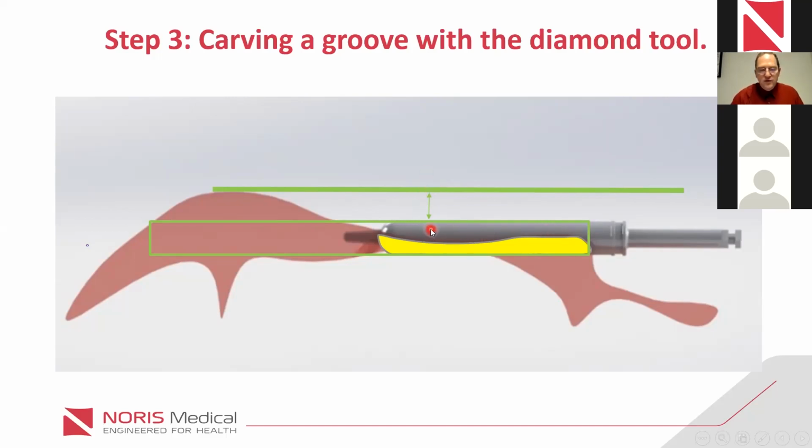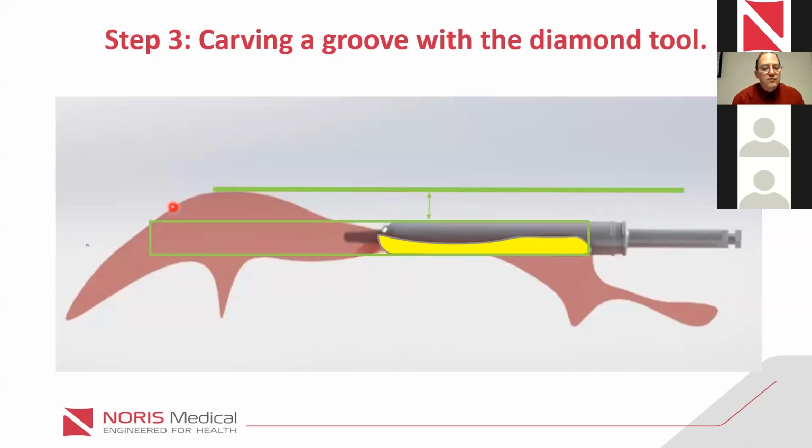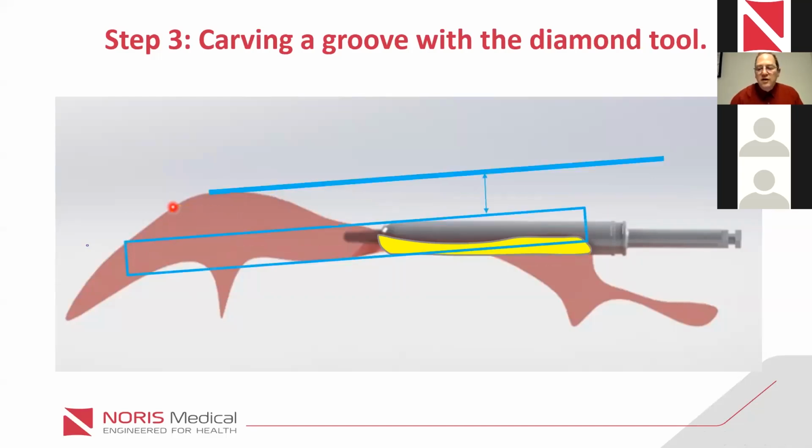And if for a reason you went with the diamond too deep on the alveolar ridge, leaving the same entering point, look what happened. You're much higher, and the distance is shorter. Look at the point where the implant is now, related to the point where the green was before. The green is a much longer implant. And if we didn't go far enough with the diamond, you didn't go further down to the position you were supposed to go, then this distance would be longer, and you have a much longer implant.